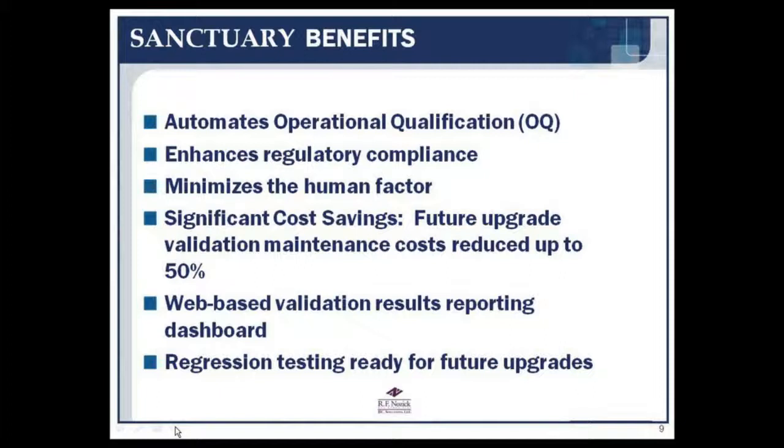Once we have installed Sanctuary and we have done an operational qualification, the next time it'll be a very reduced price, up to 50%. And why is this? Because we already have the foundation, we're using automation, and we can do things quicker. Web-based validation results reporting dashboard, that'll be in the Quality Manager, and Janelle will show that in a minute.